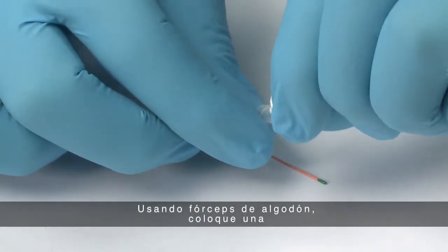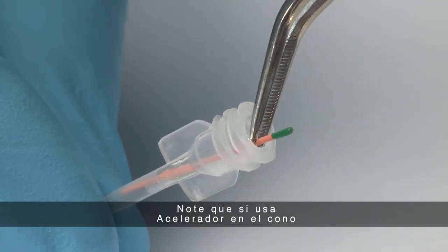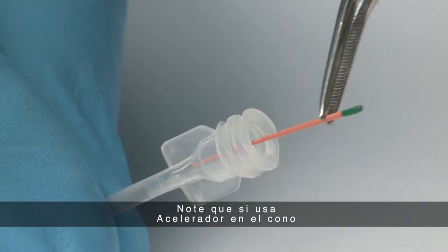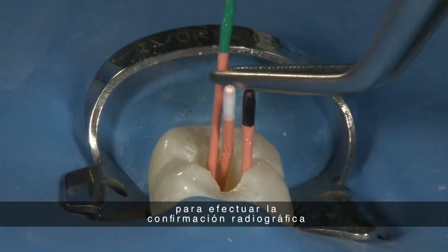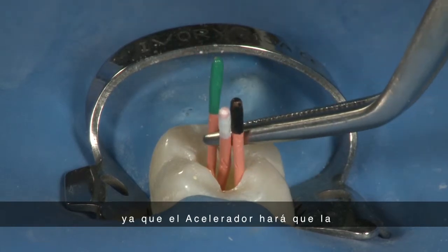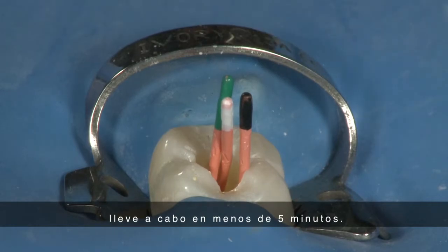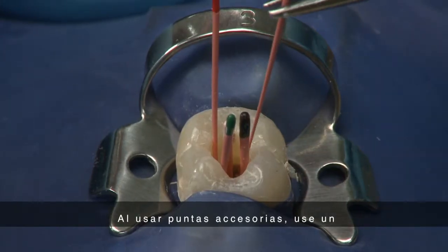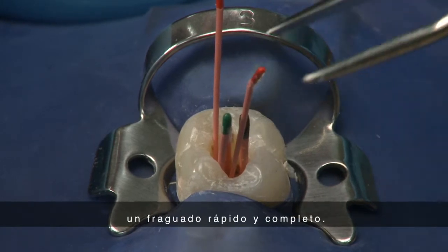Using cotton forceps, place an EndoREZ gutta percha point into the chemical. Please note, if you use Accelerator on the master EndoREZ point, you will need to move quickly for radiographic confirmation, as the Accelerator will cause the EndoREZ to polymerize in less than 5 minutes. When using accessory points, use a minimum of 2 to 3 points to assure a rapid and complete set.